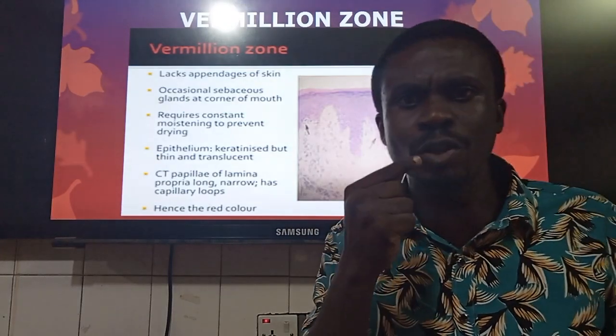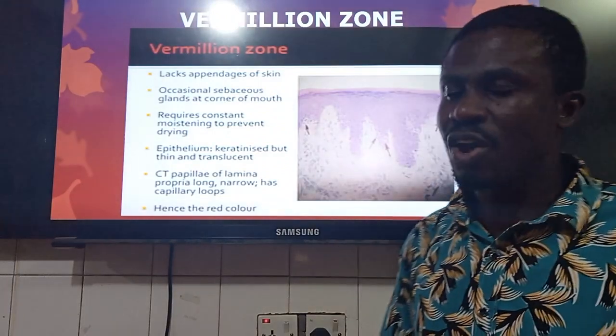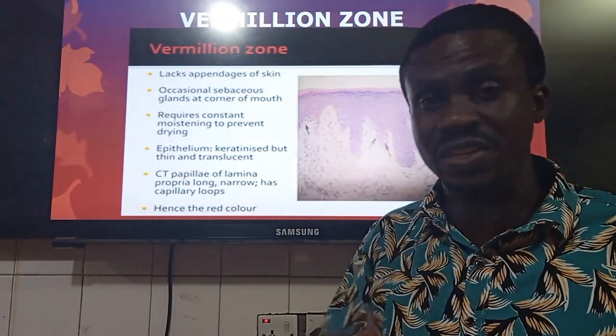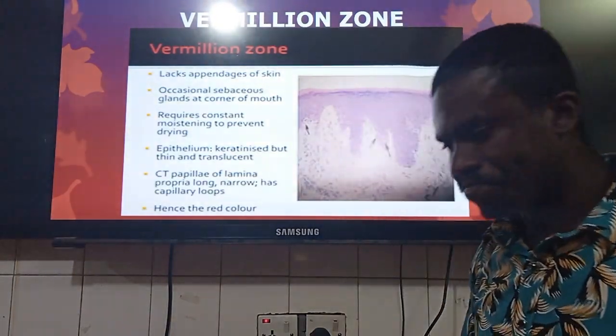And that is why the vermilion zone, that's one thing I want you to know, appears reddish or pinkish. Unlike the case of the cutaneous area, the external skin surface, and of course the inner oral surface. Very important for you to appreciate that.